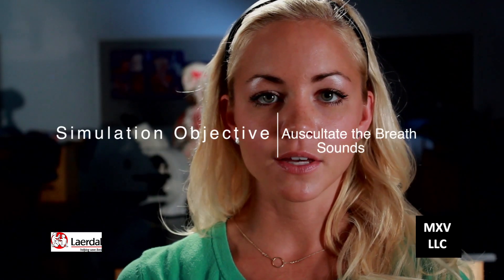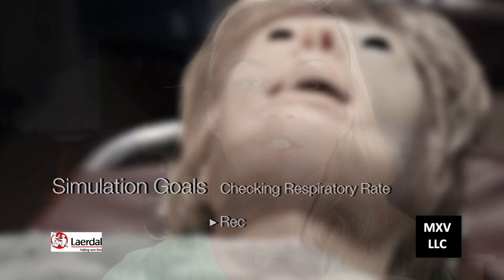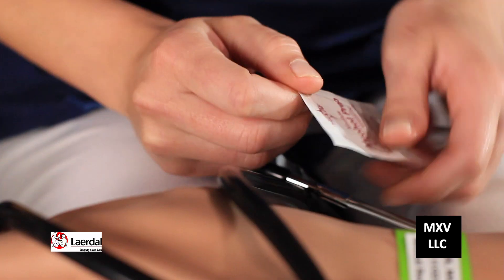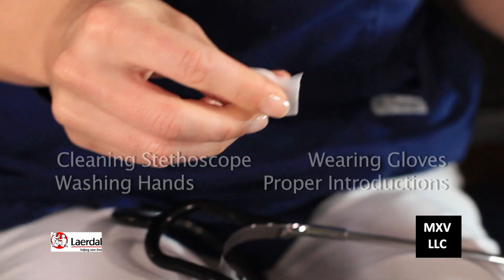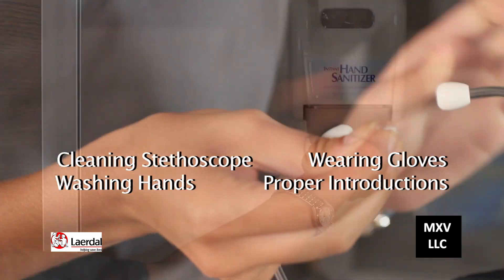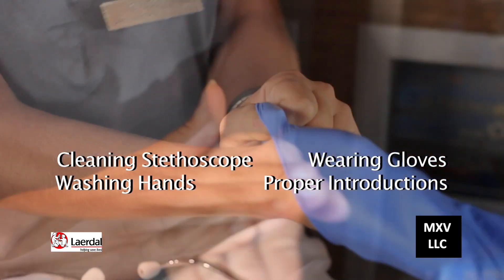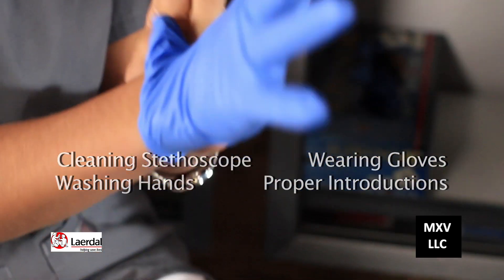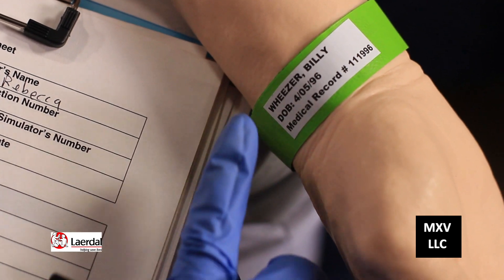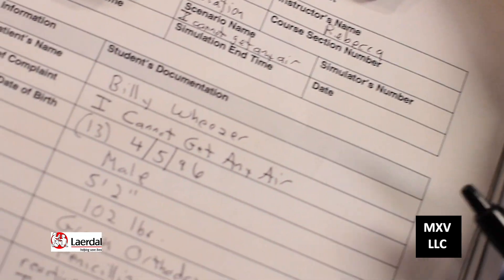Today's simulation objective involves auscultating the breath sounds. Your simulation goals should include checking respiratory rate and accurately reporting your findings. Along with the essential clinical skills, your instructors will be looking for the mandatory cleaning of your stethoscope, washing your hands, wearing your gloves, and demonstrating a proper introduction to your patient, including checking the patient name and birthday on the ID bracelet with that on the medical records.